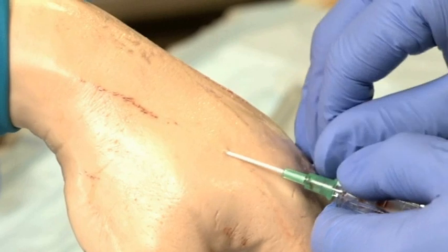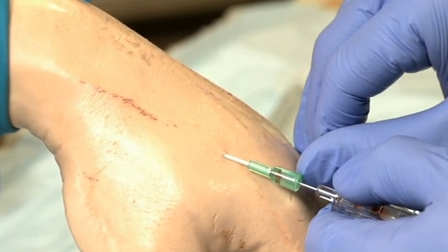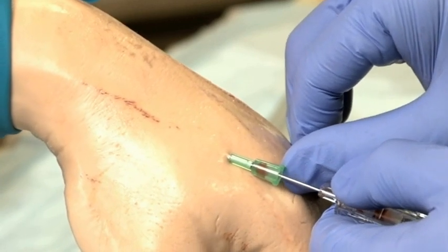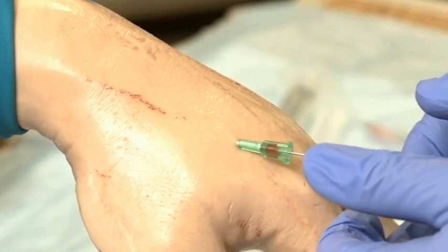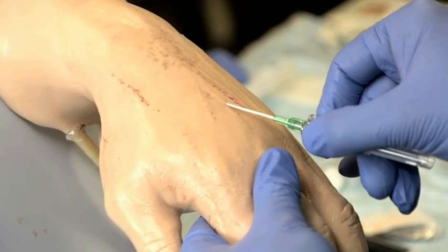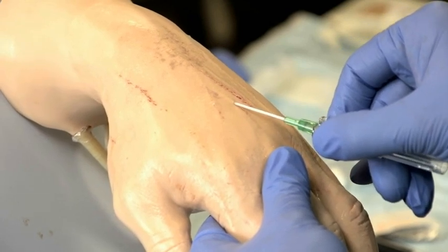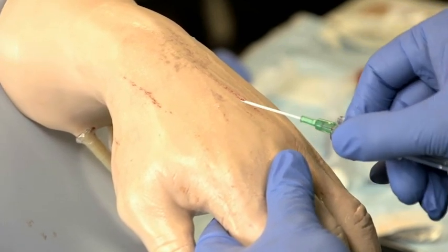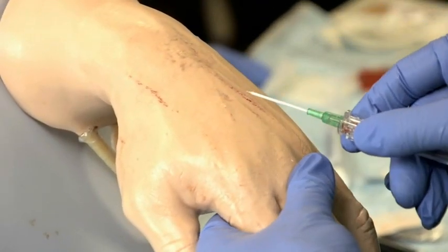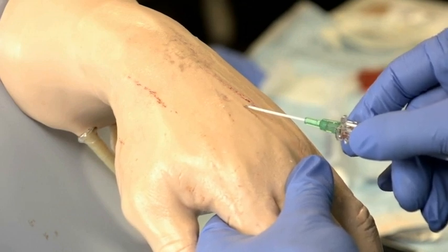This must be done because the catheter tip is a little behind the needle tip. Advance the plastic catheter over the needle and into the vein. If properly placed in the vein, the catheter should advance easily and painlessly. If there's resistance or pain, assume that the catheter is not in the vein. In most cases, it's preferable to stop the attempt and start over at a new site. However, particularly if there are few suitable sites for insertion, it may be possible to pull the catheter back a bit and then advance it into the vein.